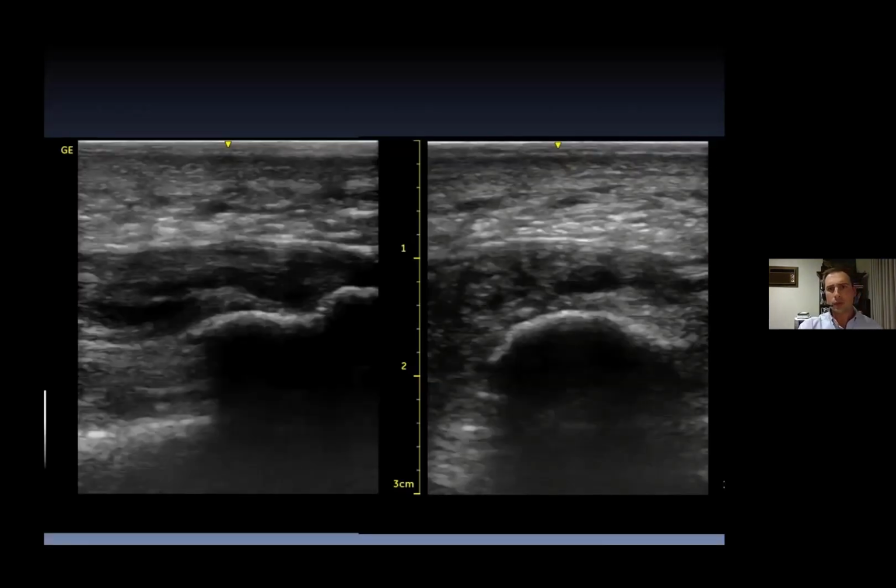When it comes to the tissue, this is an ultrasound, and in this particular view, we're looking at a long axis view. So this is the heel bone here. We've got the plantar fascia inserting into that heel bone. We've got the fat tissue here, and we've got the skin. Now, if you've looked at a few ultrasounds of the plantar fascia, what you'll recognize is that this is quite thick. It's also quite hypoechoic, meaning there's a lot of fluid in there. And we see these delamination tears.